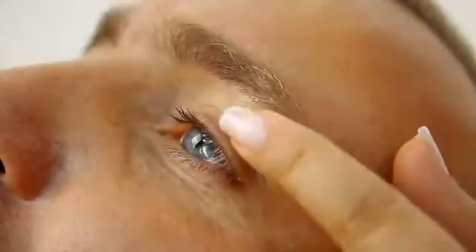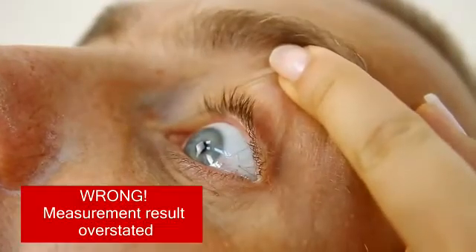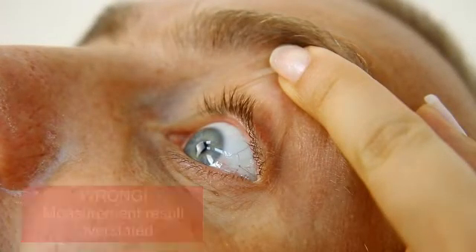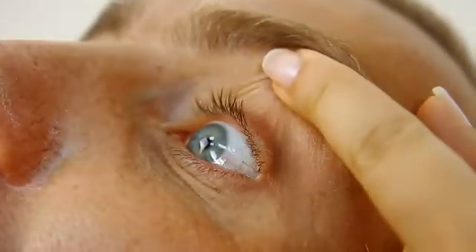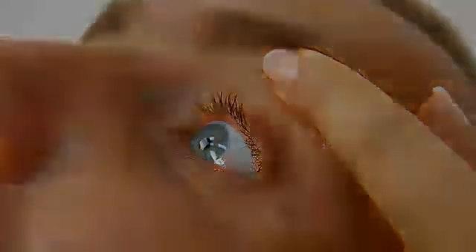The eyelid is stretched incorrectly. Possible mistakes. The eyelid edge is below the limbus and touches the cornea. The eyelid edge is too high above the limbus. For precise measurements, the eyelid edge must be 1 millimeter apart from the limbus.